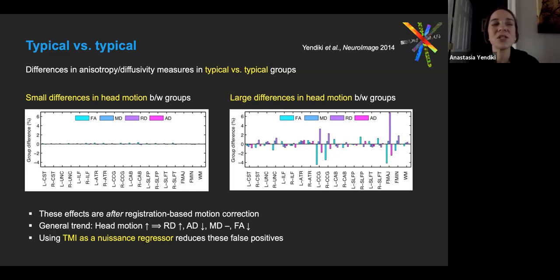And one thing we looked at in the paper was if we just removed some of the outliers, like did a histogram of the different motion measures and just tried to throw out some of the ones that had high motion measures.